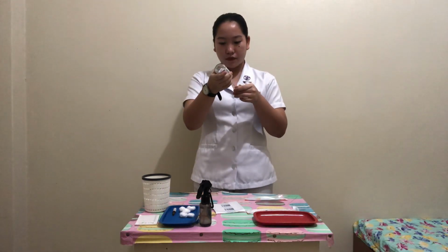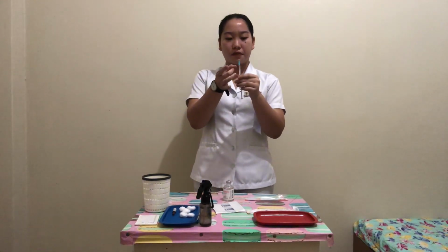And also eject the air remaining at the top of the syringe into the vial. So ejecting air gives an accurate measurement of the medication because a small amount of air will not harm the tissues. And if there is an air bubble inside the syringe, tap the barrel.